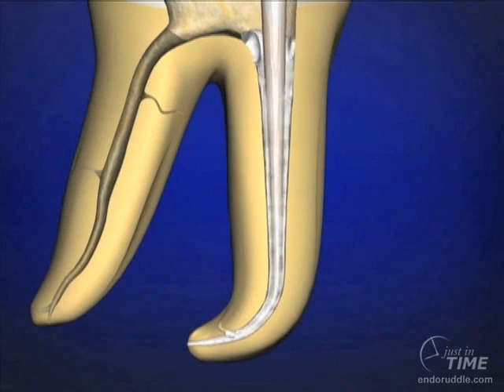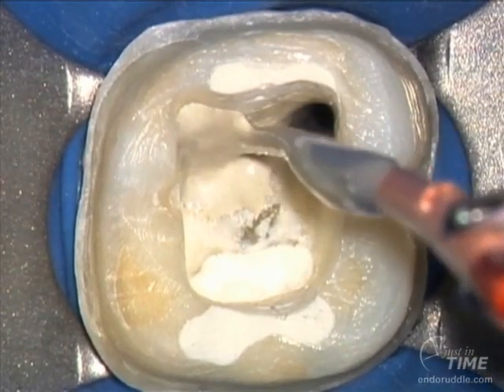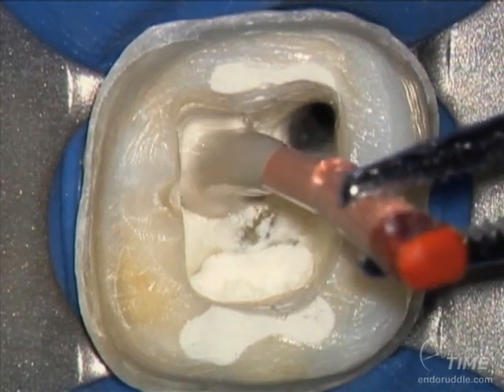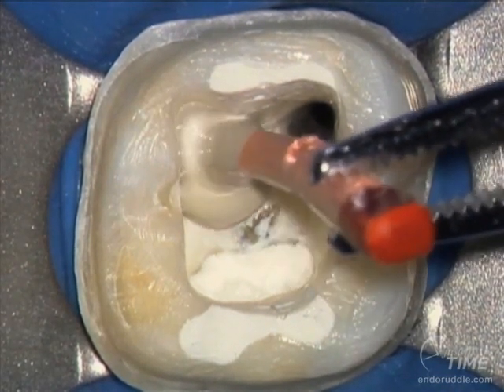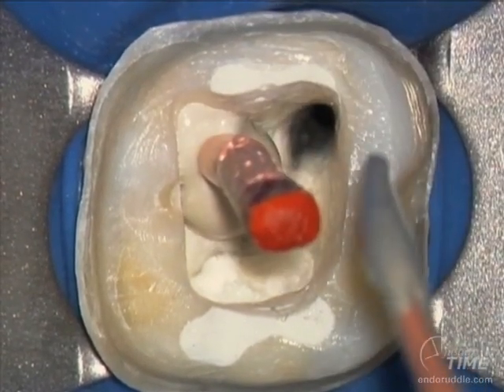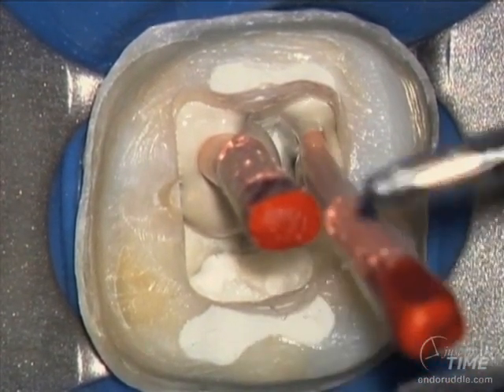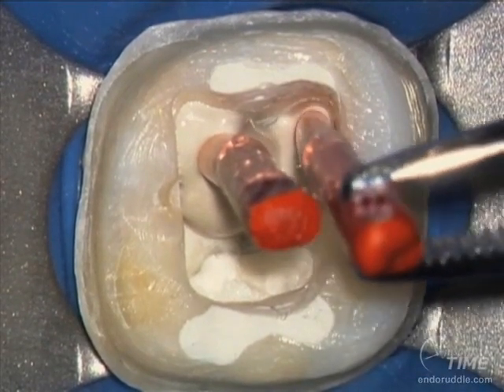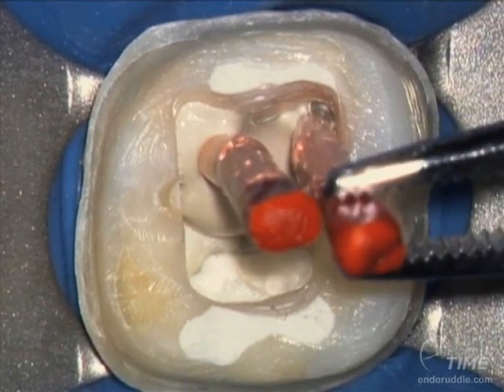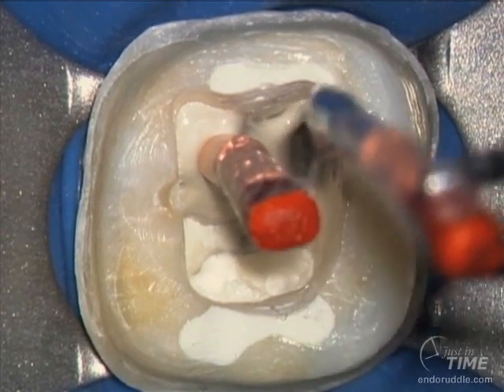Sealer is introduced on a buttered cone. Notice how the cement refluxes coronally. Withdraw the cone and check if it's still buttered — if it is, you have enough sealer, and you can tease the cone back to place. Teasing the cone to place allows sealer to vent back up coronally so that you don't needlessly express sealer through the foramen. We'll also pull the cone out and inspect its lateral surfaces to make sure it is uniformly buttered.